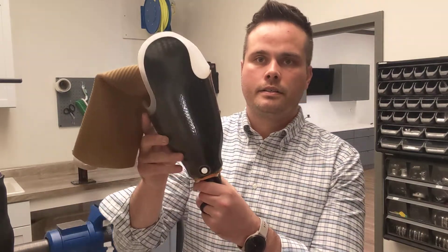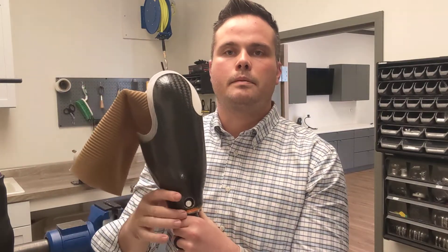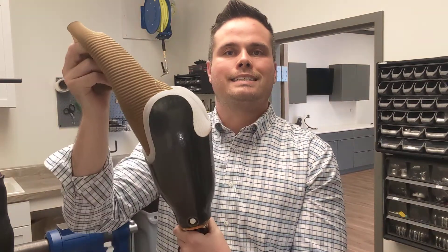There are three main types that we'll discuss today. The first type is pin lock. This is a pin locking system — this is a test socket that we're about to fit, and you can see the hole in there where the gel liner will actually mechanically lock into the socket. Here's an example of a laminated version of that with the liner connected. The liner goes in, it snaps into the bottom with this plunger pin, and it's a really nice and easy system to manage.